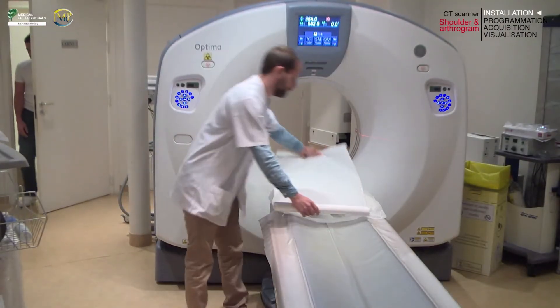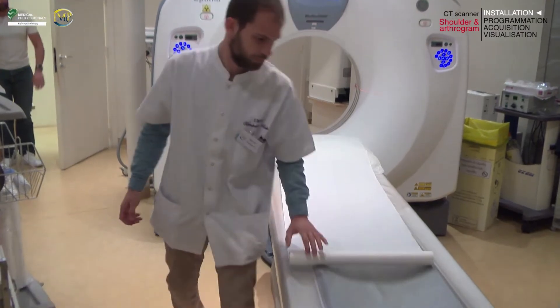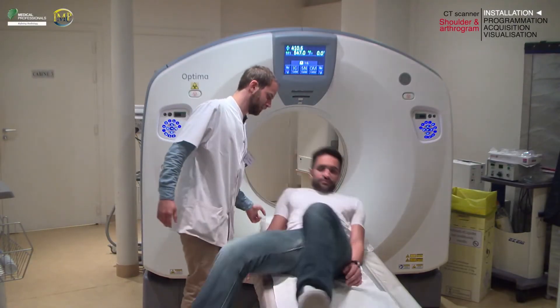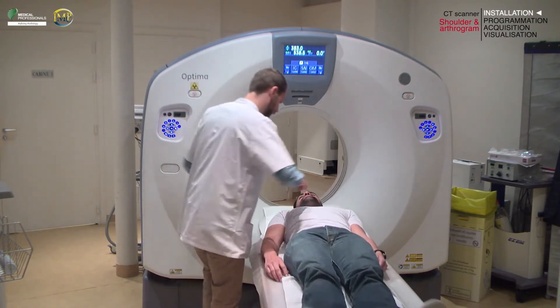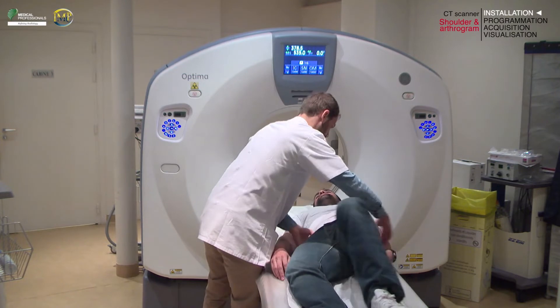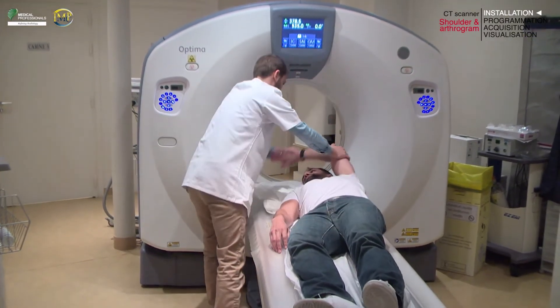After verifying the patient's identity using at least two identifiers such as first name, last name, and date of birth, place your patient in the supine position, head first, with the affected arm along their body and the other above their head.